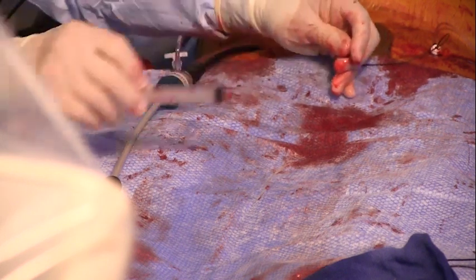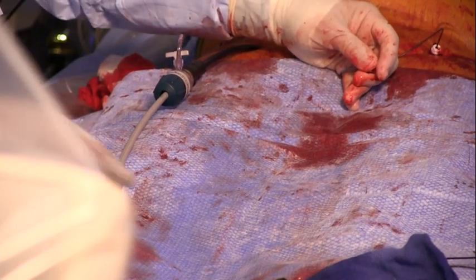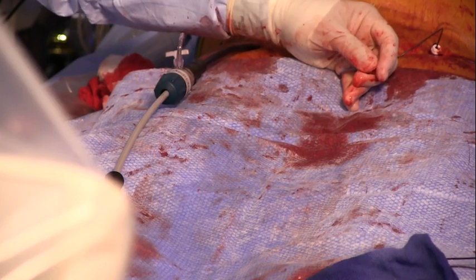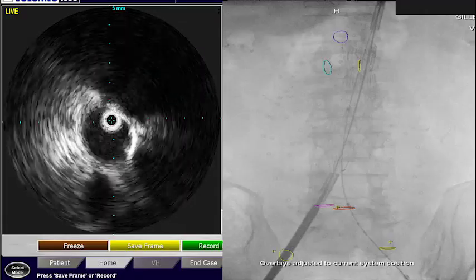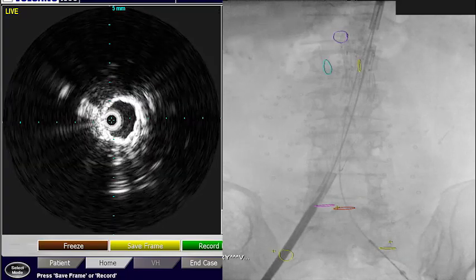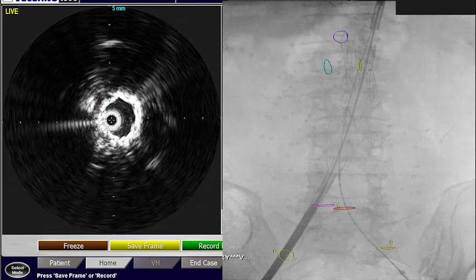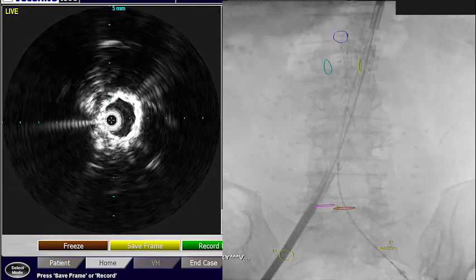After assuming gate cannulation and advancing sufficient wire, remove the cannulation catheter and exchange for the IVUS catheter to visually confirm that the wire has cannulated the contralateral gate. Once proper positioning has been confirmed, exchange the floppy guide wire for a Lundequist extra stiff wire.